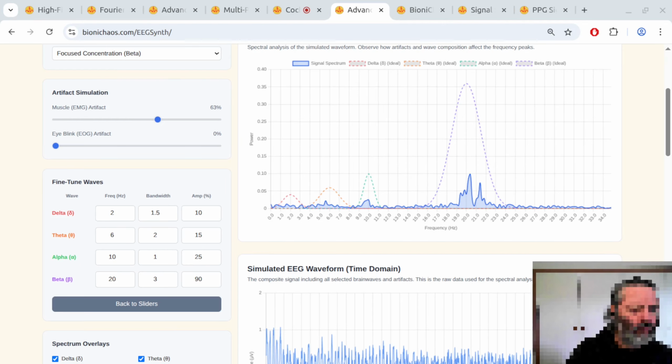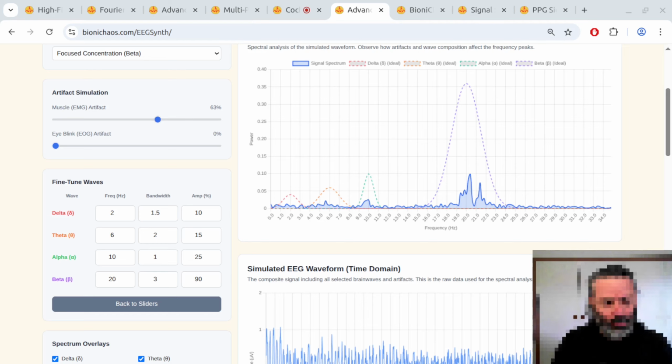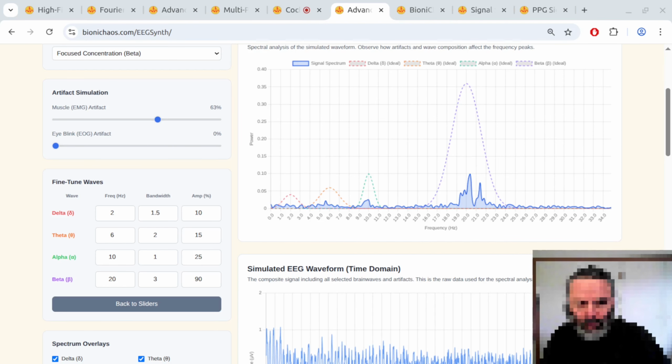That's where some really powerful algorithms come into play. Things like blind source separation, or BSS, and especially independent component analysis, ICA. ICA sounds complex. What's the idea? Imagine trying to pick out one voice in a really noisy room.